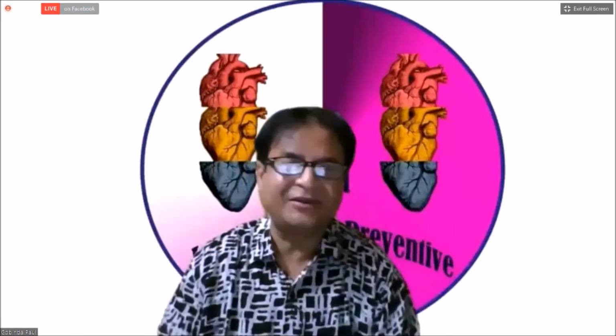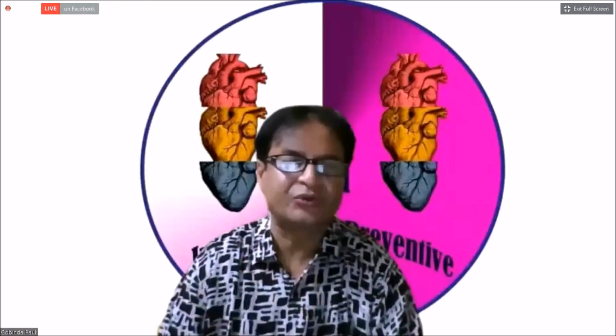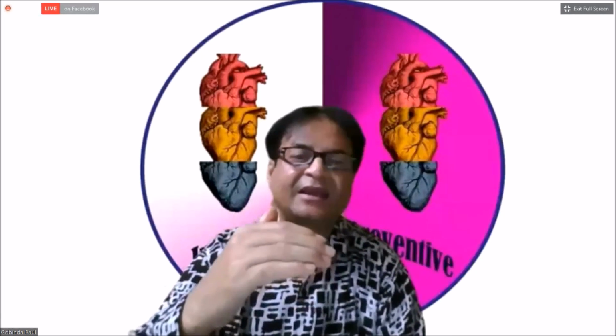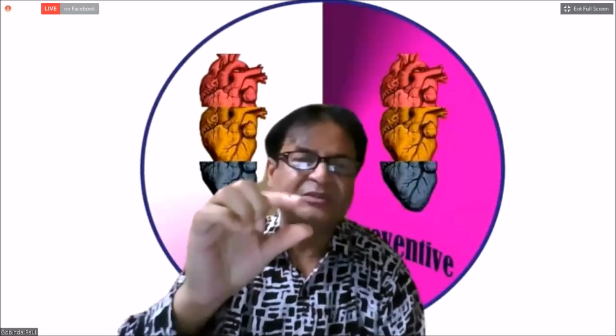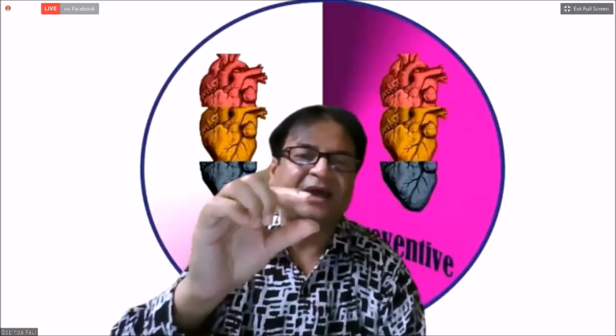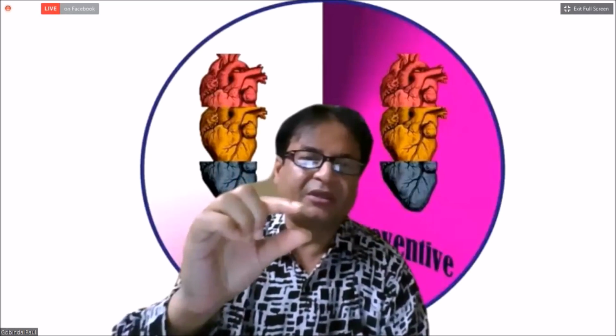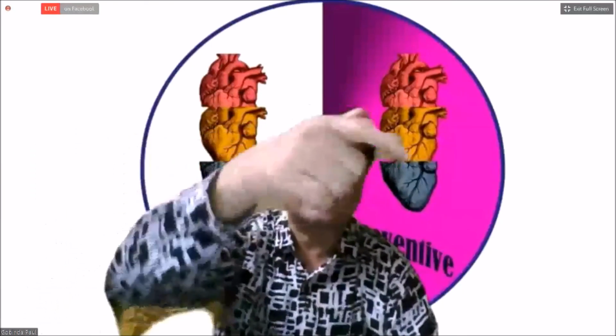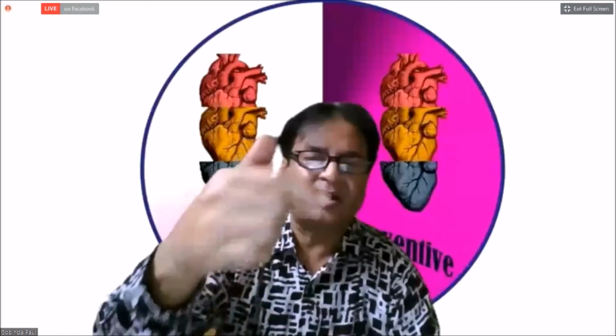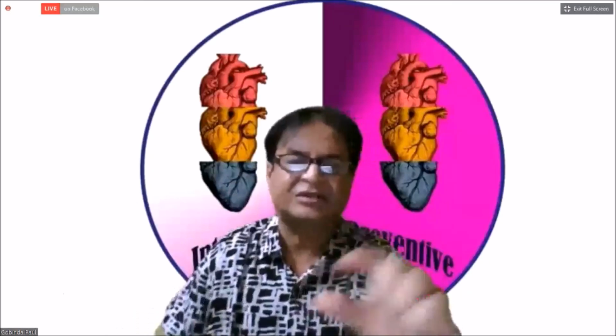I already mentioned in my slide that during measurement of the interventricular septum, we should be cautious about the RV side endocardial border of the interventricular septum and also the LV side endocardial border. These borders should be clearly visible and imaged, and then we can measure the thickness of the interventricular septum. But on the RV side there may be trabeculae, and if you take the measurement including the trabeculae, there is a false impression. It gives faulty results.